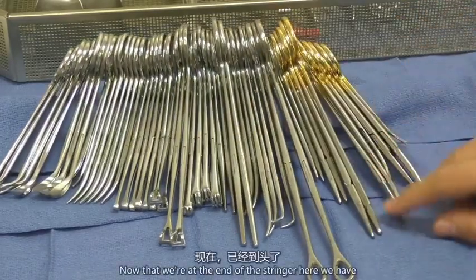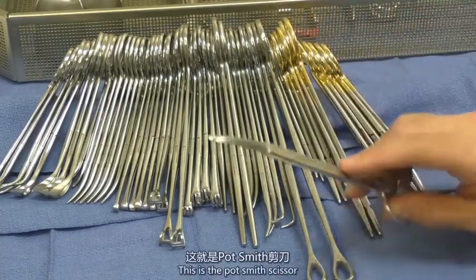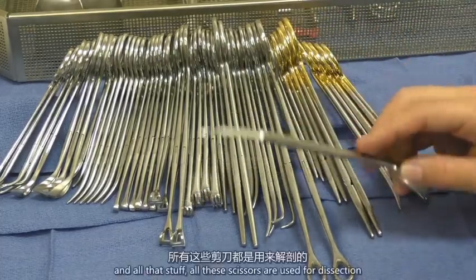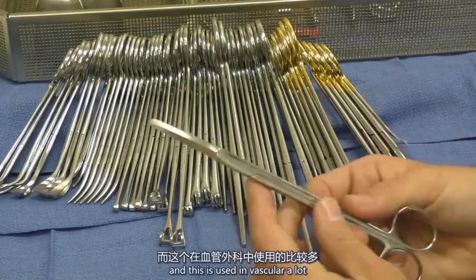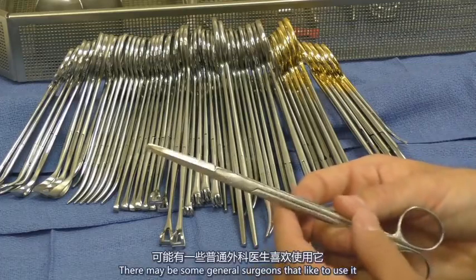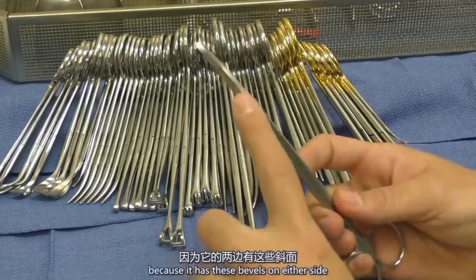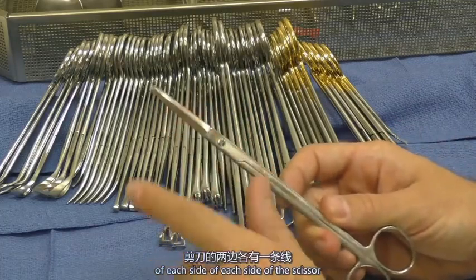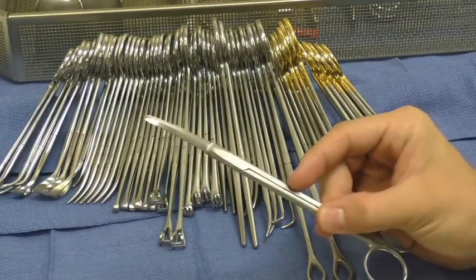Now that we're at the end of the stringer here, we have scissors that we have to go through. This is the Potts Smith scissor. This scissor obviously is used for dissection and all that stuff. All these scissors are used for dissection, and this is used in vascular a lot. I don't see it used in general surgery a lot. There may be some general surgeons that like to use it, but you will know it's a Potts Smith because it has these bevels on either side of the scissor itself, and it'll have this nice little line going to the tip of the scissor.